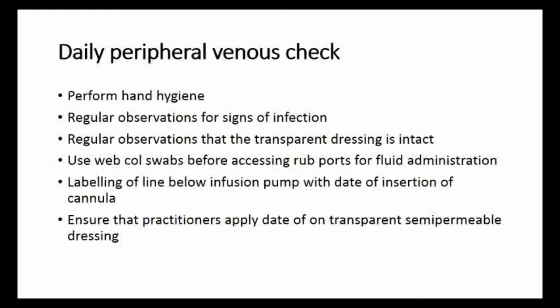The IV should be checked daily. Check if the IV is still running. Check if the dressing is still intact. And lastly, check for any signs of infection.